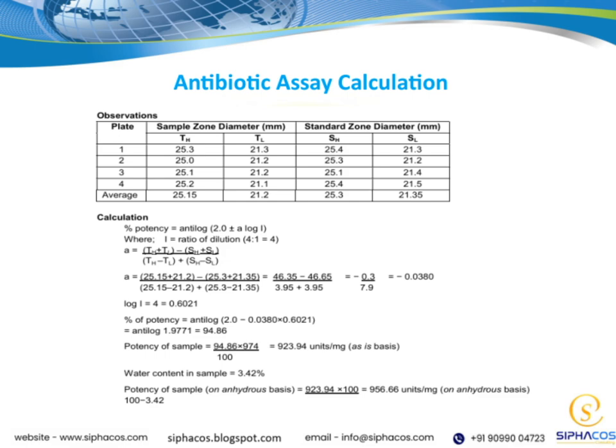As we connect this to the overall theme, remember that precise assay calculations underpin quality control in pharmaceutical production. This process helps us verify that the antibiotics meet the required standards before they reach patients. So, mastering these calculations is fundamental to our work in maintaining medication integrity.